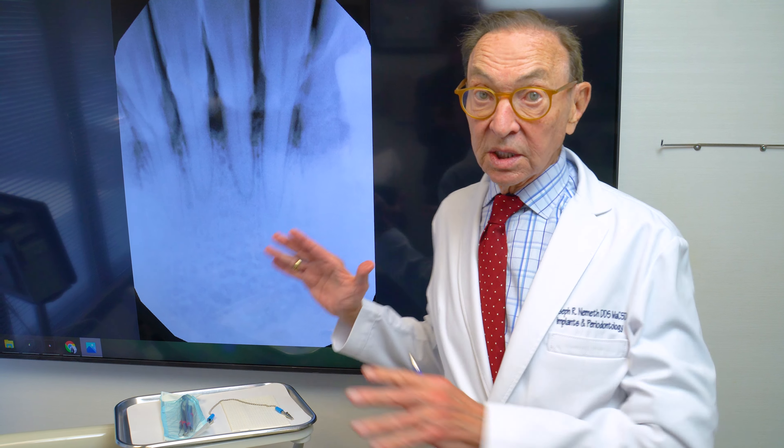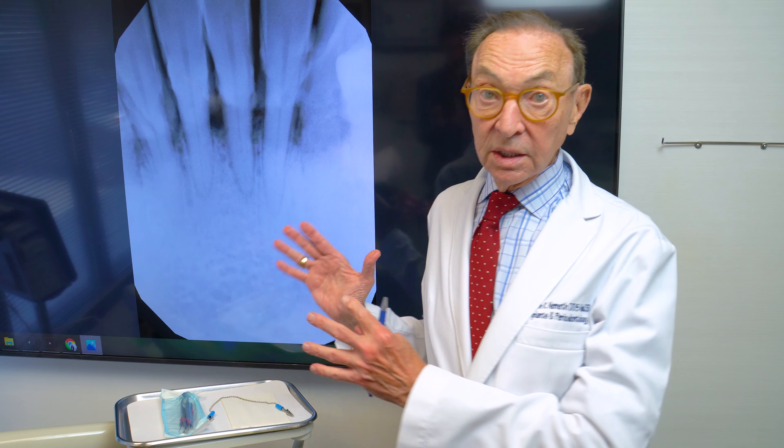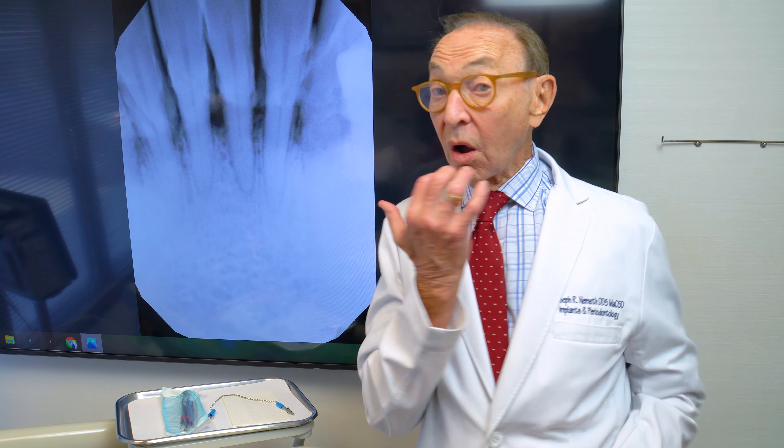So before we can do pinhole, we have to eliminate the infection. The first part of the treatment is with LANAP — eliminating the infection, eliminating all the calculus, eliminating all the tartar.